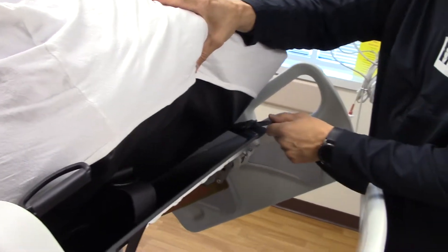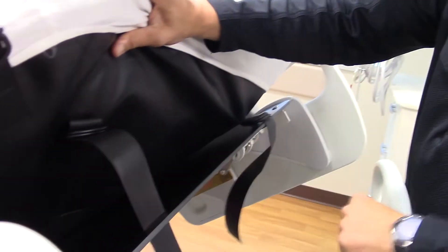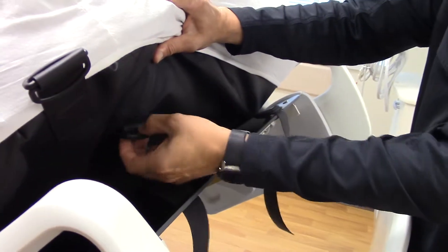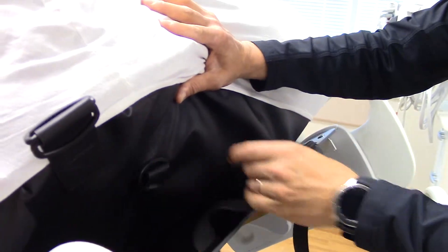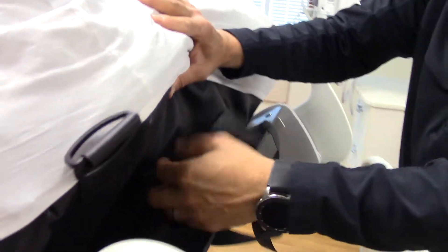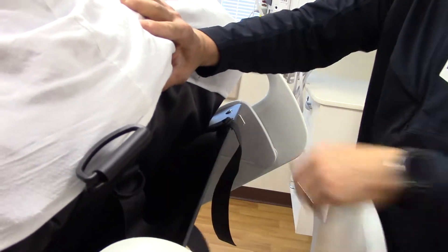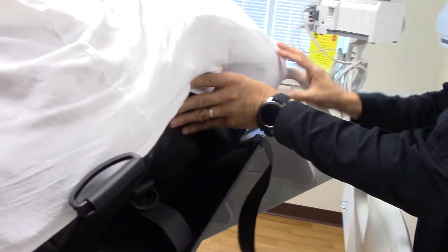If you look over here, we have one already strapped — pull this as tight as can be — and we have this one unstrapped. It's just like a belt buckle. You have two D-rings. You go through the hole in the backrest, back up through both D-rings, and then back out one, and then pull it tight like we have over here. That will ensure the mattress is always in the correct position.